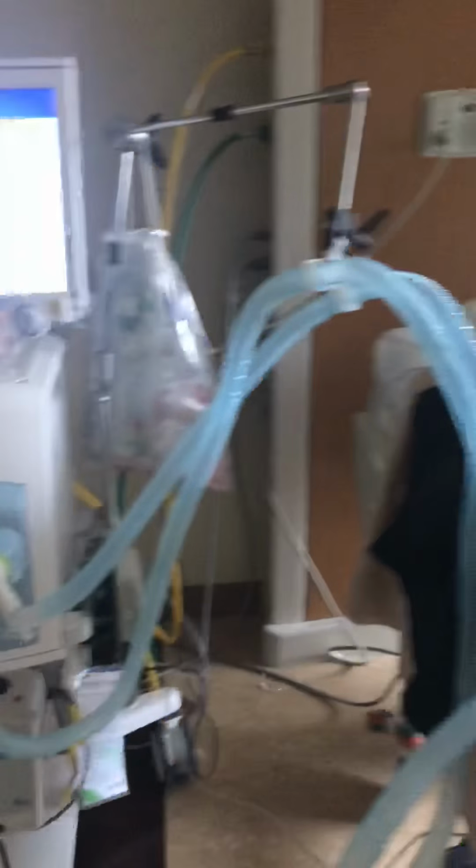Listen to their lungs. Are their lungs bilaterally rising and falling? Just kind of those things. Explain what you're doing, of course, to the patient, even though they might not be conscious, but it just gives reassurance. And that is all of those.